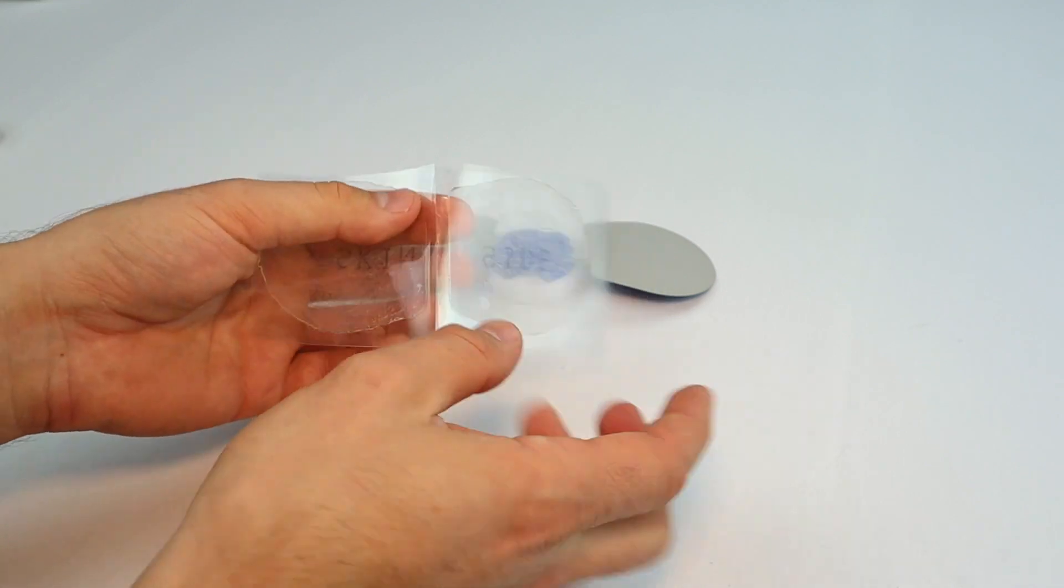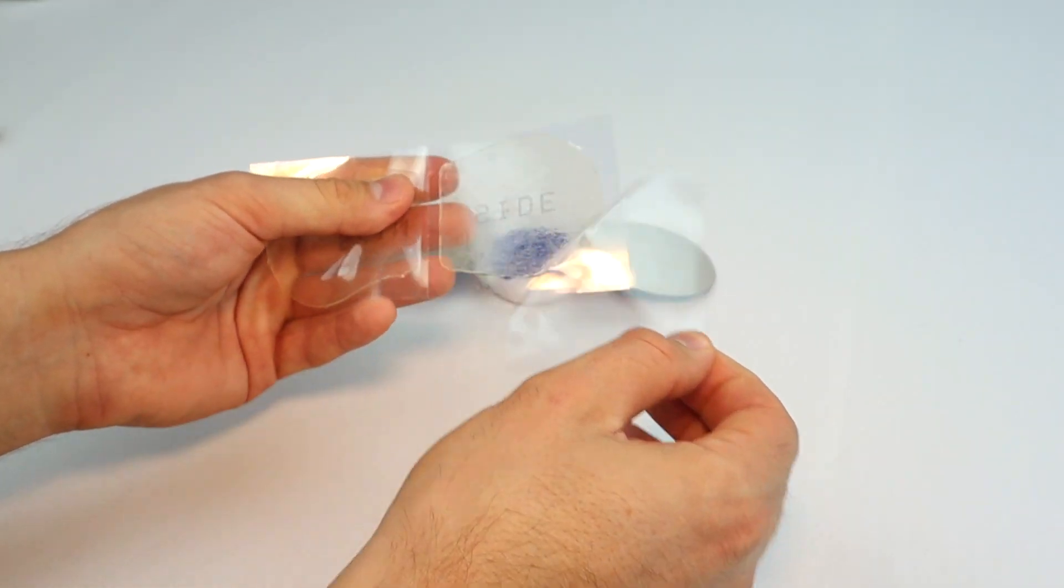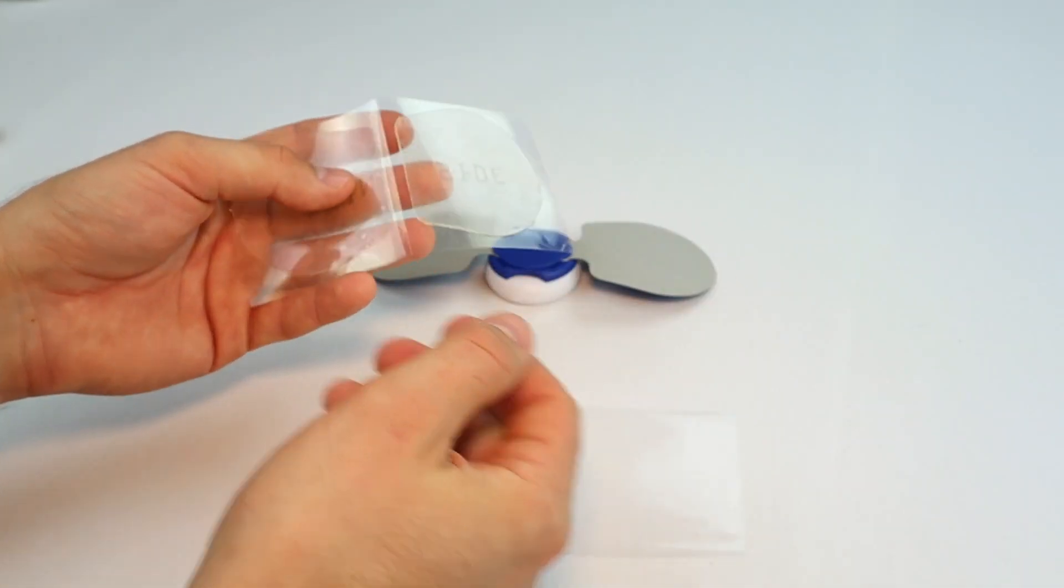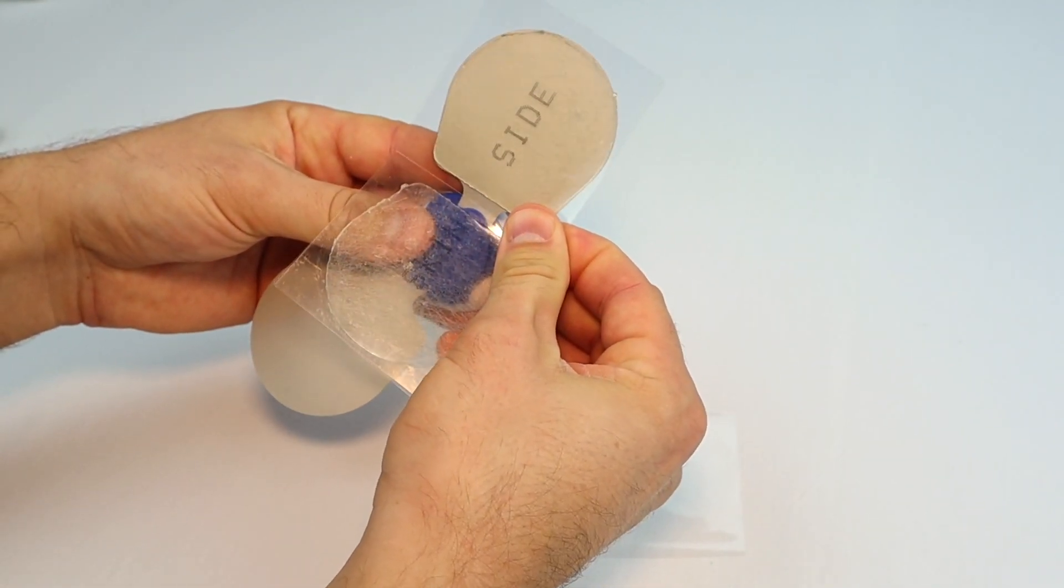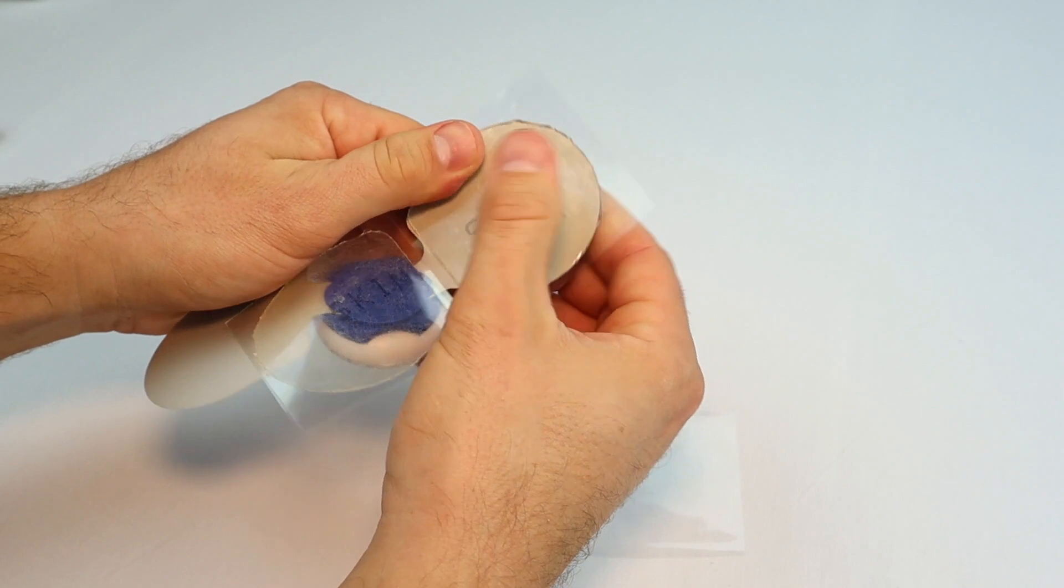What you want to do is flip it over, peel off the plastic to expose the sticky side, then line it up with the wing, put it on, and press it firmly.